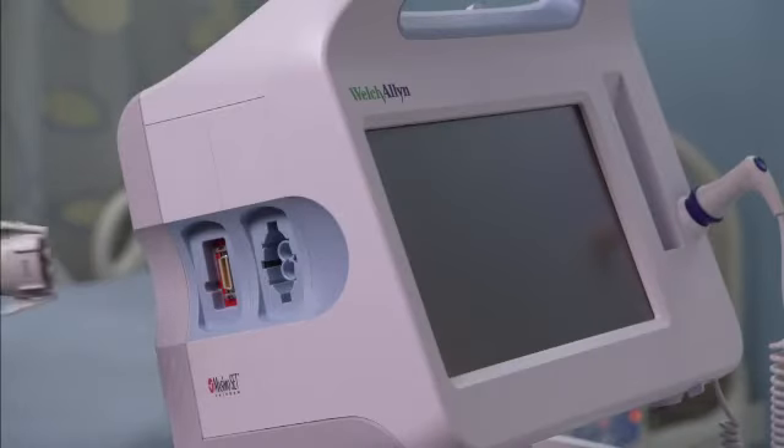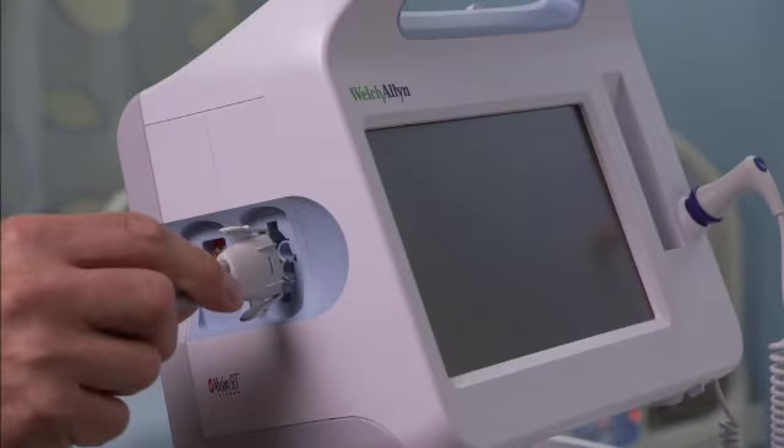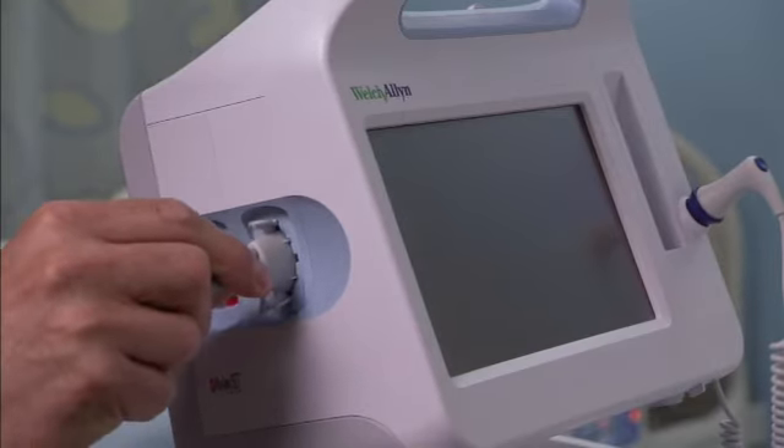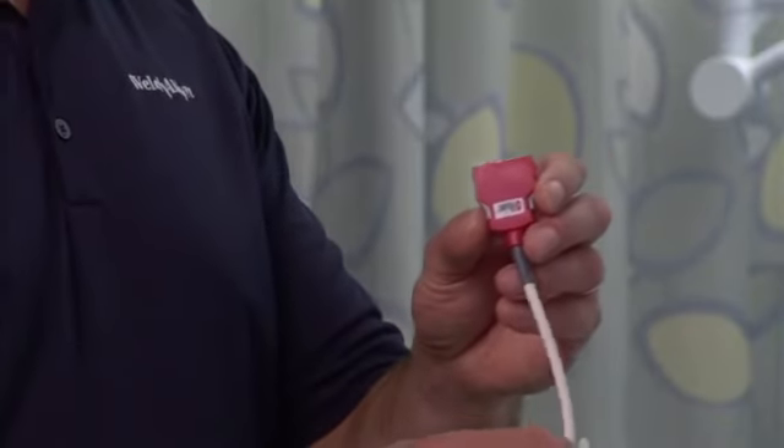To connect the NIBP hose, align the hose connector with the hose connector port on the side of the monitor. Insert the hose connector, pressing firmly until it clicks into place.